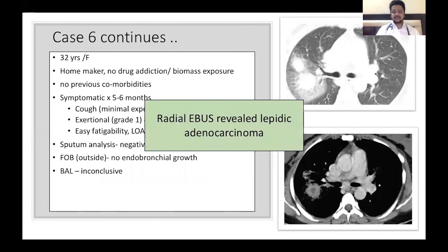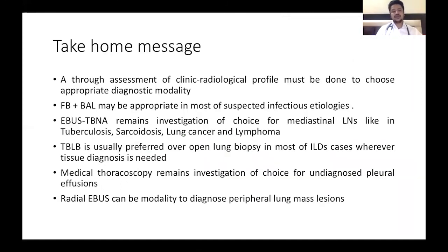So in case 6, we did a radial EBUS biopsy, and it showed lepidic adenocarcinoma, which was initially suspected to be pneumonia, just bacterial pneumonia. So my take-home message is that a thorough assessment of the clinical and radiological profile must be done to choose the appropriate diagnostic modality.